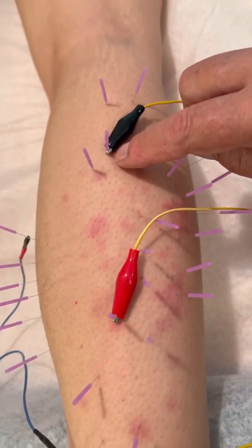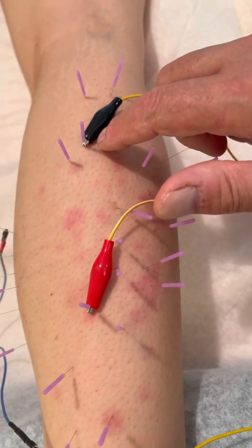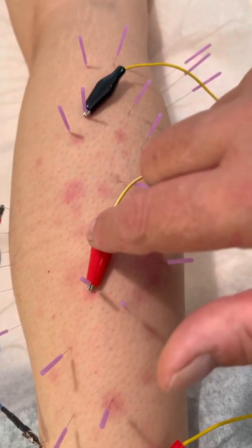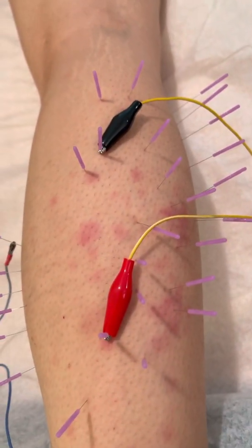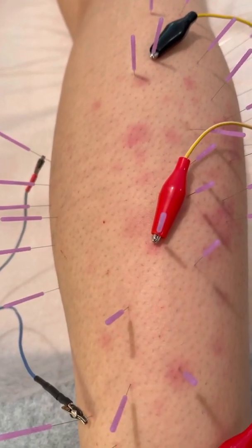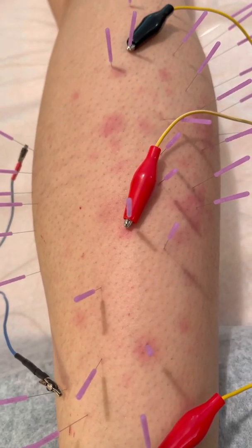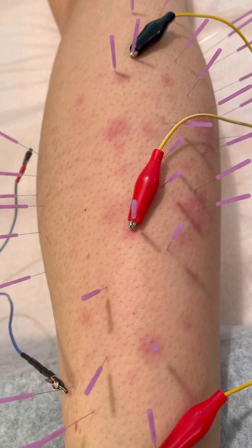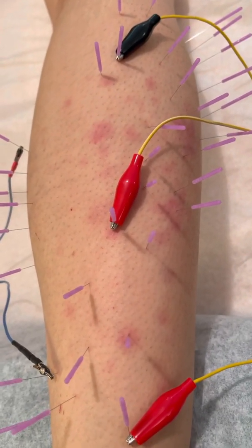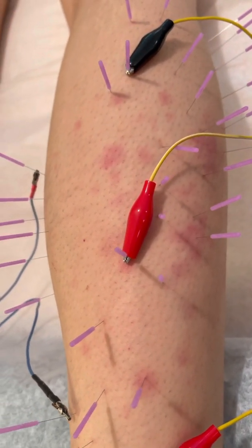So here I'm electrically stimulating the soleus and also the lateral gastroc. So this electrode is attached to this electrode, and it's causing the muscle to see these needles moving that there's nothing attached to. That's the soleus, and it's causing the muscles to contract and release, contract and release. And so it adds to the ability to get the muscles to unlock and go back to a lengthened position.